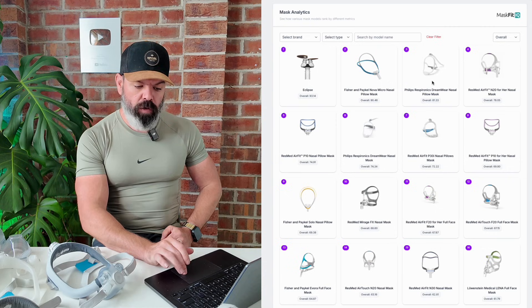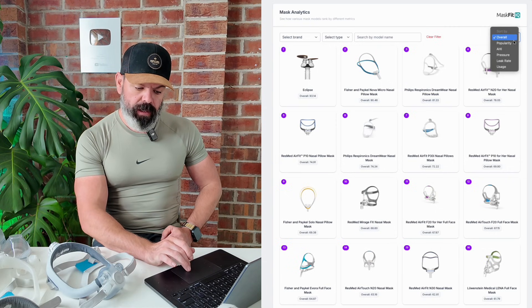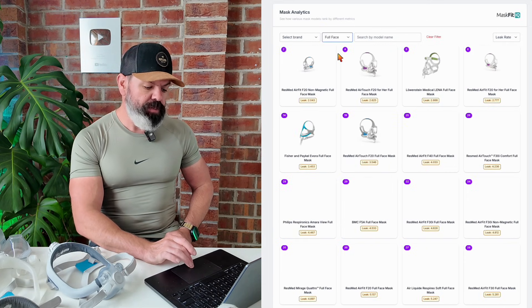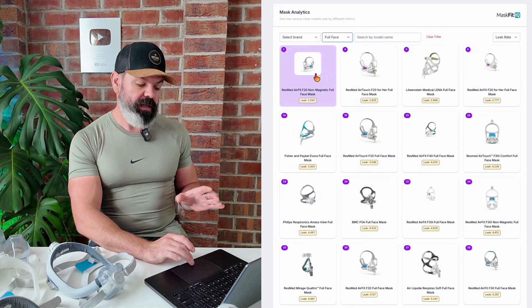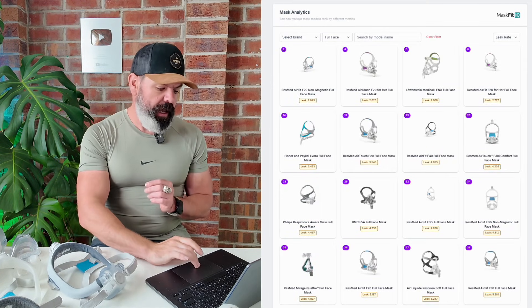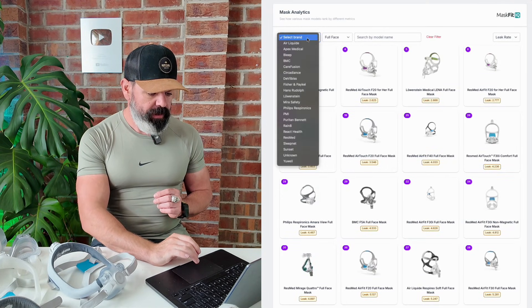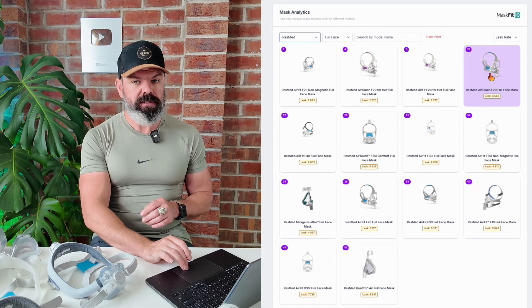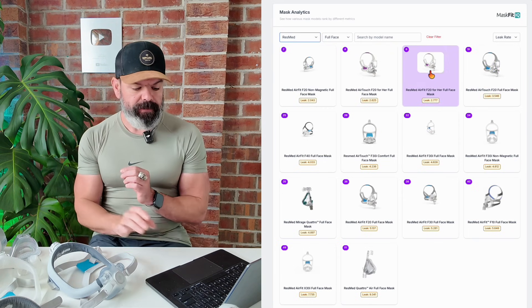The great thing about our platform is, let's say you want to come in here and you're looking for a full face mask but you want one that's got a great seal. You can just go to mask analytics, go overall, change that to leak, then select type and go full face. We can see right here that the best performing full face mask for leak is the F20.